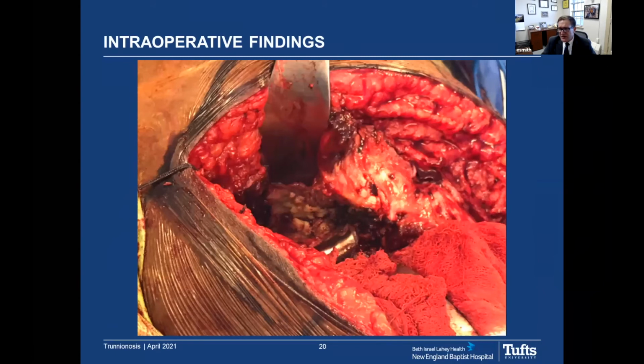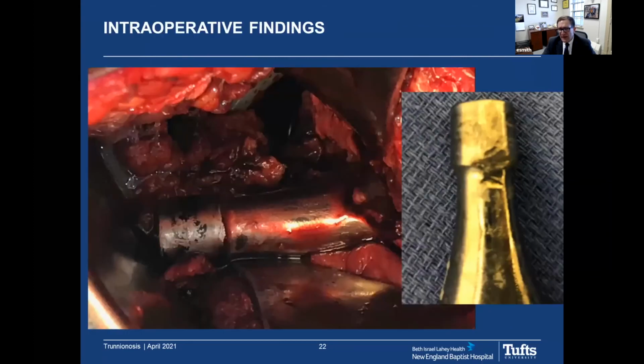You can see there's blackened staining from the corrosion, and the yellowish thickened tissue suggestive of an adverse local tissue reaction. A closer view shows the trunnion. On the right side here is some trunnion damage from the bone tamp used to remove the femoral head.